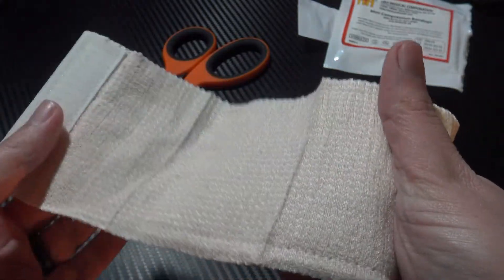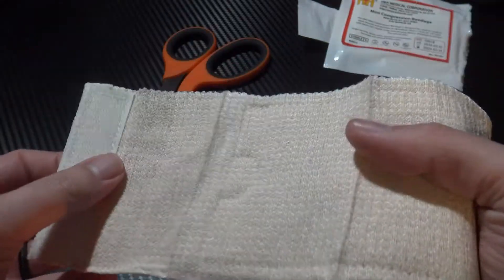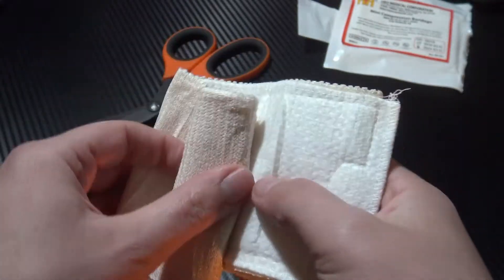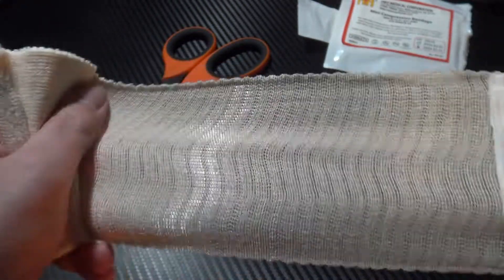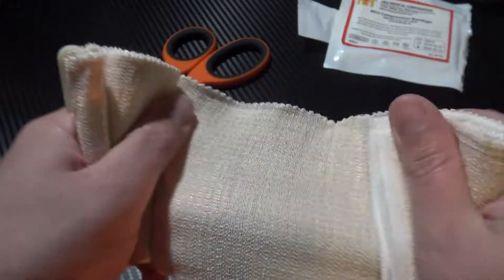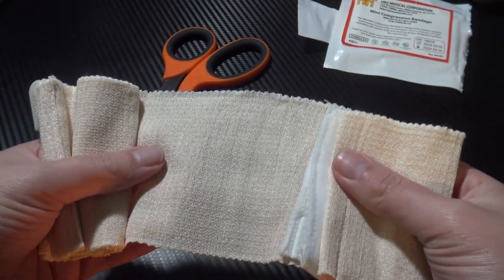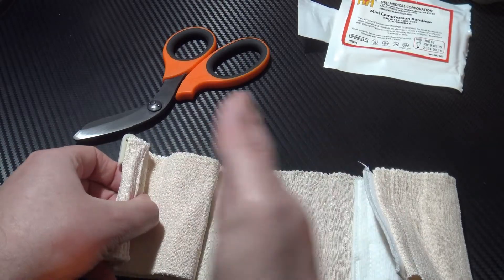Here on the short end you have some velcro. What this does is it allows you to apply it more easily — as it grips itself, it's easier for one-handed application. As we open the bandage material up, you can see you have that elasticated material, which is really good for helping apply that firm direct pressure, which is what you want to control major bleeding. As you make your way to the end, you have four feet of material here.